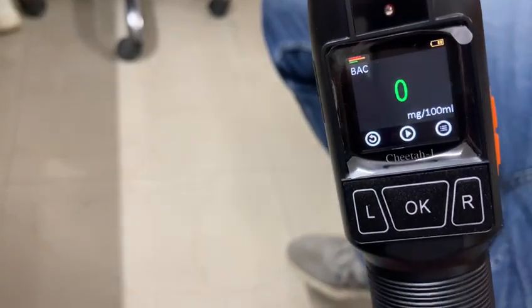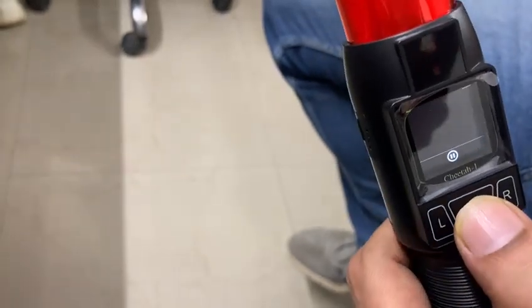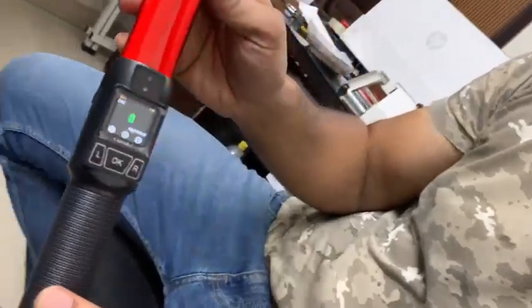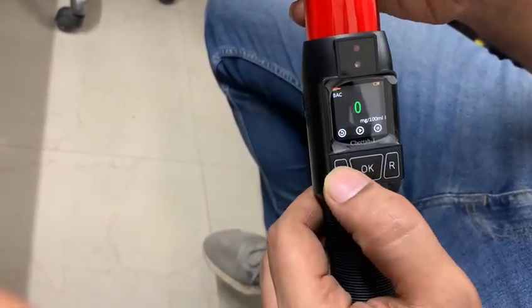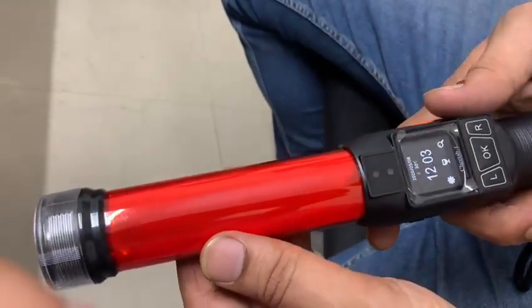As you can see, the reading is 0 mg per 100 ml. That is the basic overview of this device — the Cheetah 1.